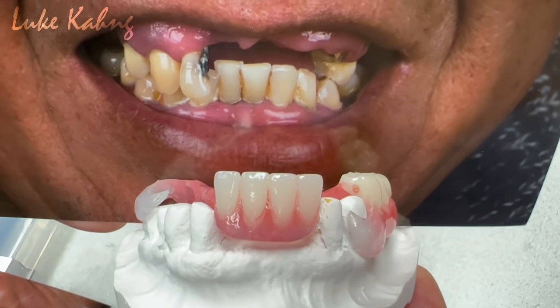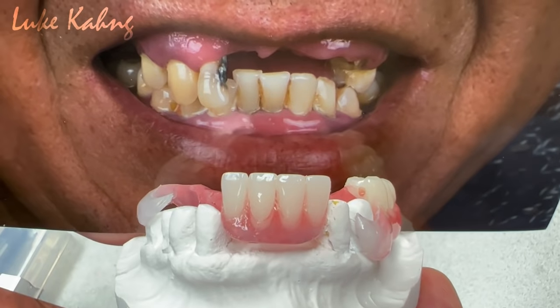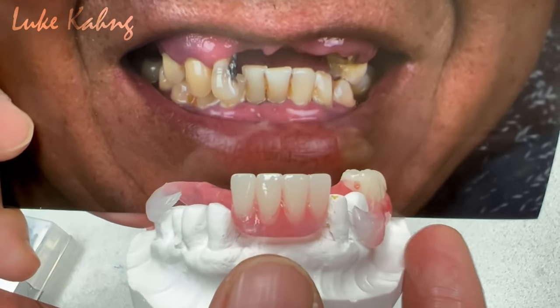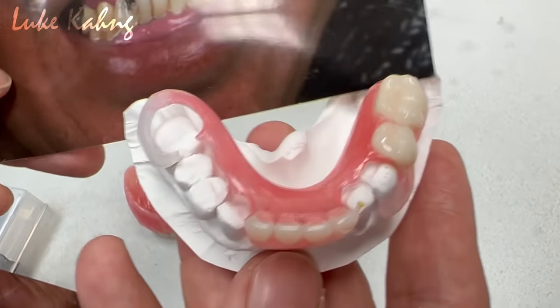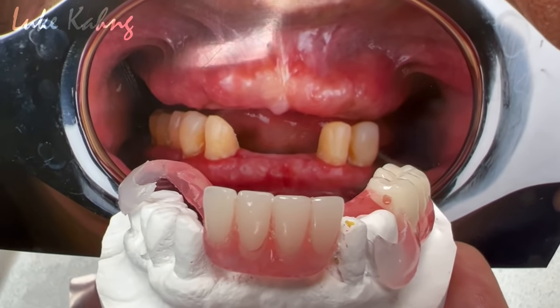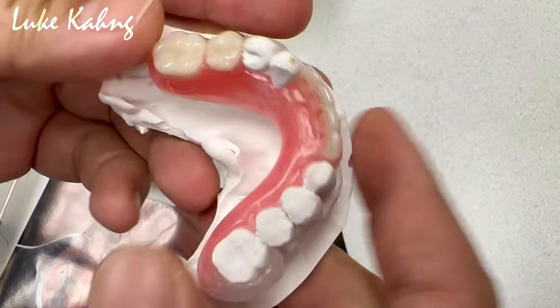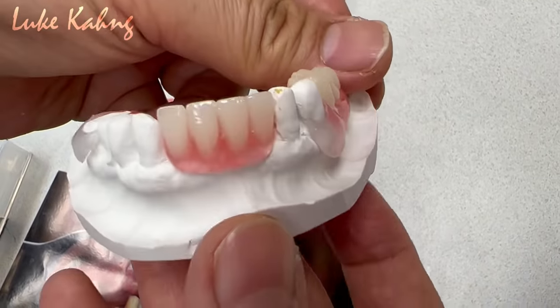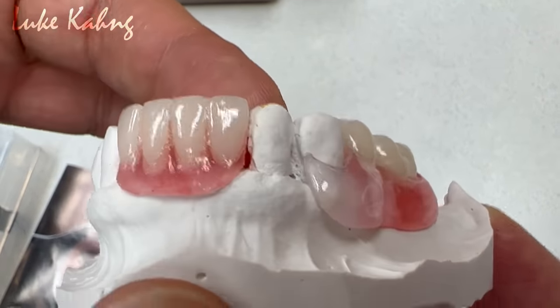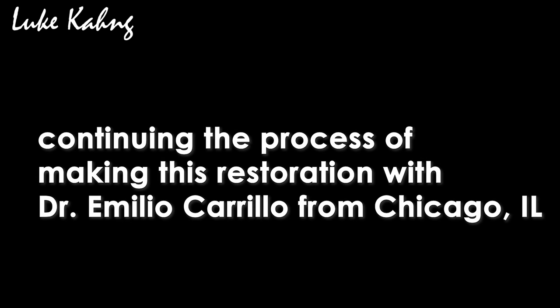This is a previous patient who had the teeth, I'm talking about lower teeth, extracted after healing. This is the final flex partial fabricated, which the patient has just like that. Okay, so we're going to try it in the patient's mouth, just like this. Okay, so this is for lower cosmetic TCS unbreakable partial cases.